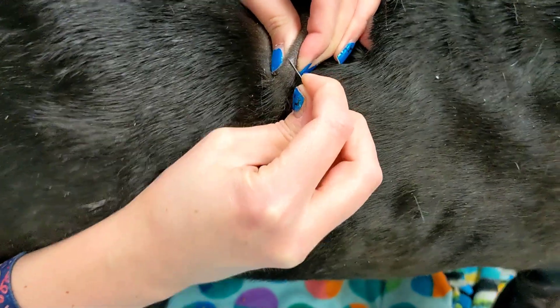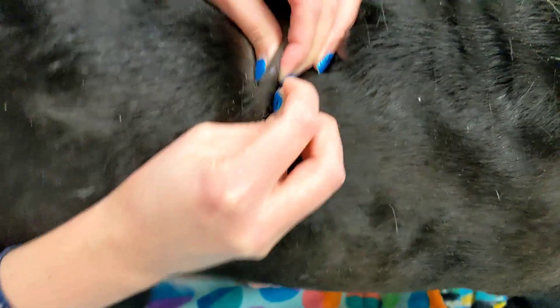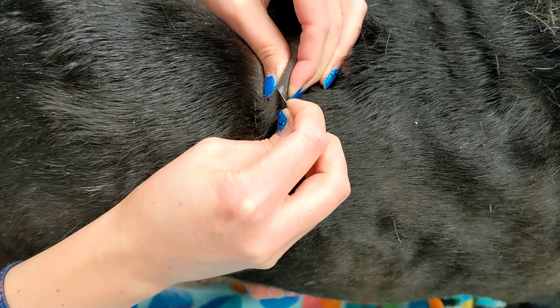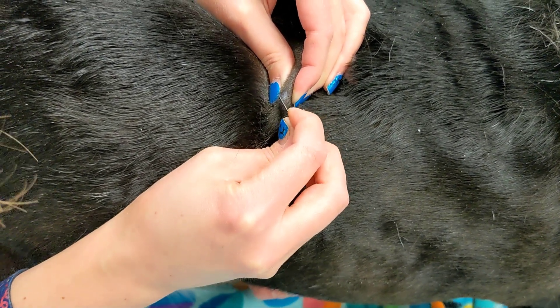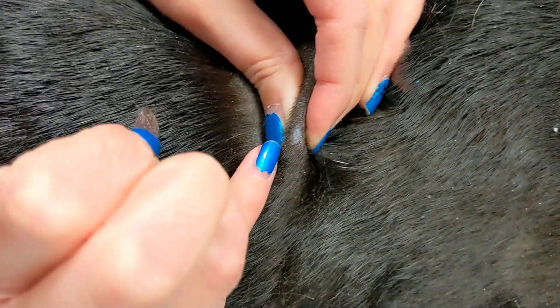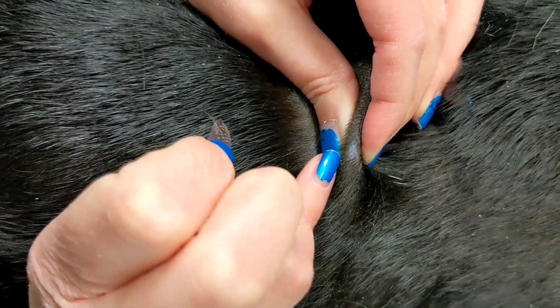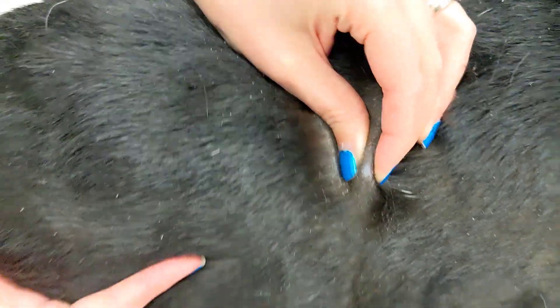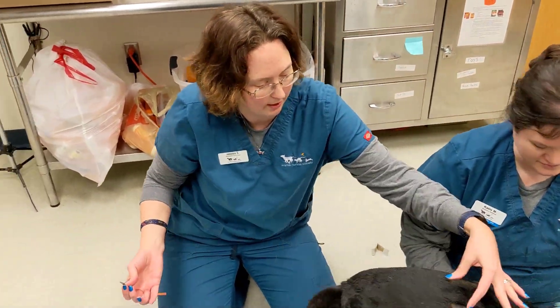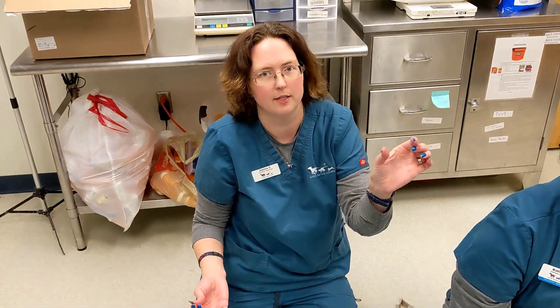You have thick skin, dude. And try not to slice yourself in the process. If you look real close, you can see a little bit of blood color there. We're going to do that in three or four spots where the hair loss is — again, along the edge where the regrowth is.